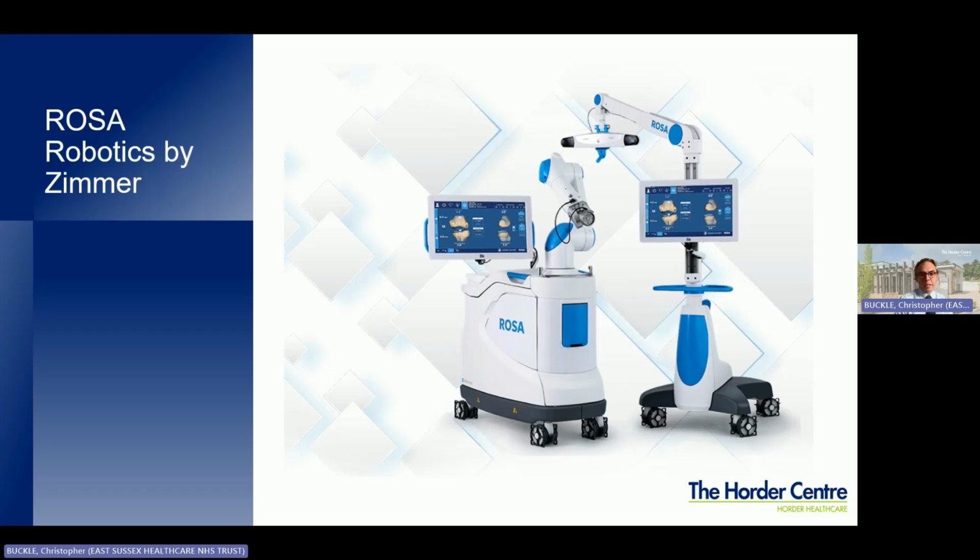In particular, some of the advantages relate to how accurately you can put knee replacements in, and therefore more accurately being able to reproduce a patient's normal anatomy to better produce a normal function of a knee replacement afterwards. And so this is the robotic system we use here at the Horder Centre. It's made by a company who make the implants, Zimmer Biomet, a worldwide, well-established company producing this ROSA robot, which works for knee replacements, but also for other joint replacements as well.